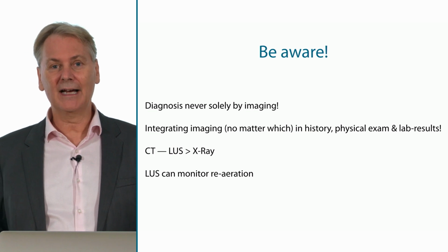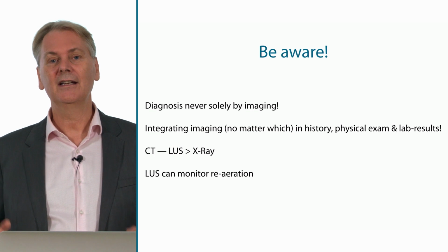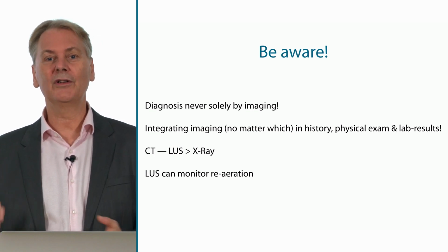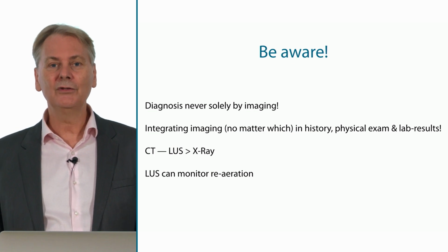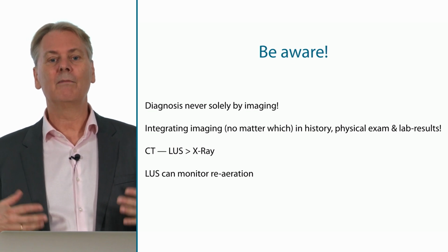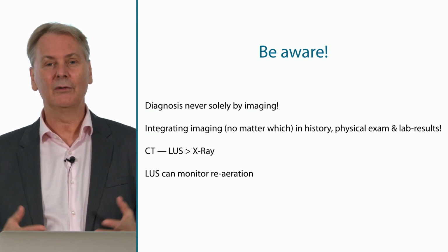Still, these imaging modalities are very, very important when you want to learn lung ultrasound, because it is a means of controlling or checking what you're actually seeing. And finally, use lung ultrasound so that you can monitor patients and see how they progress or maybe improve with the help of therapy.